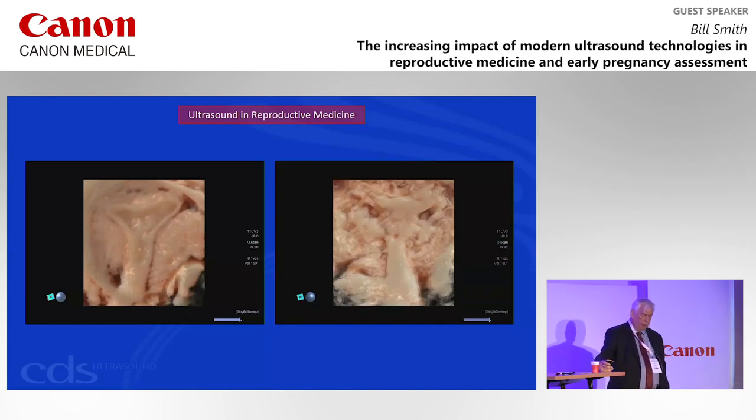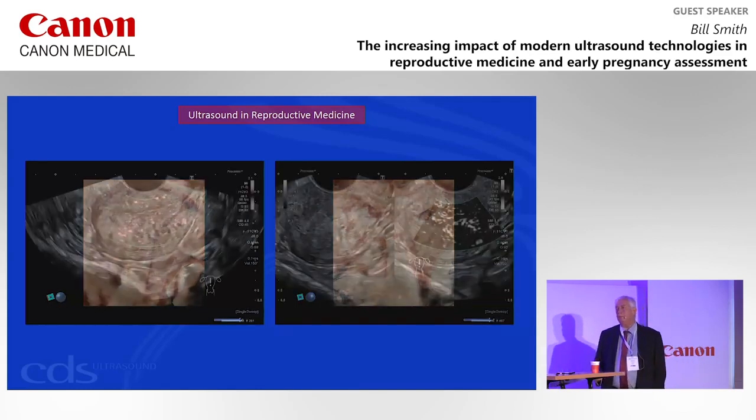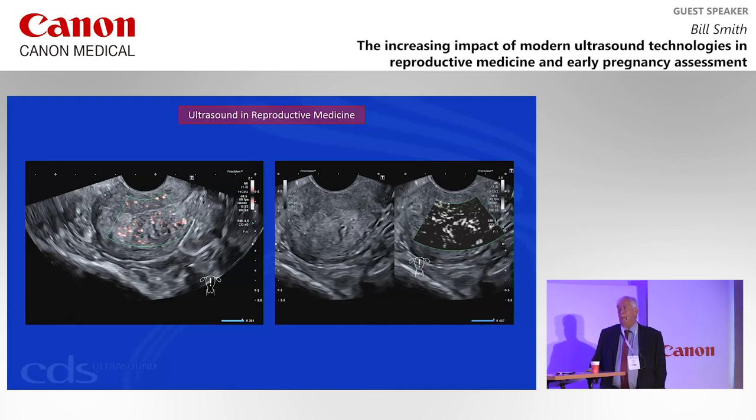I just put this one as quite obvious in terms of looking at the endometrial myometrial interface, and just an example of really extensive adenomyosis, obliterating that interface with adhesions within the cavity. And again, we expect to see increased blood flow with adenomyosis. Endometriosis is very, very estrogen driven, and therefore estrogen dominance would play a major effect in the development of this particular disease.